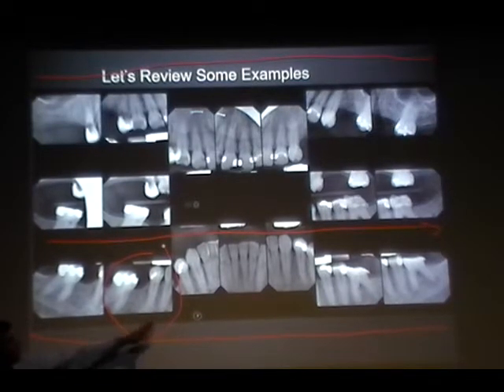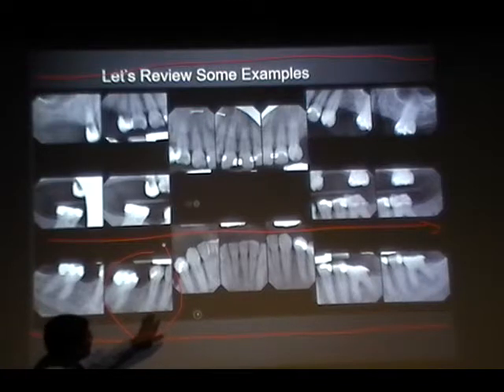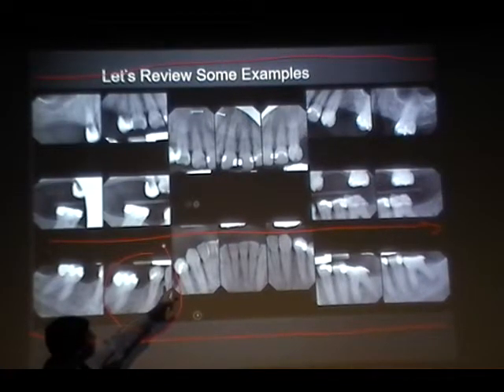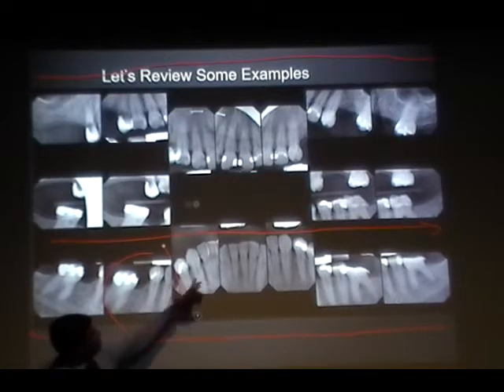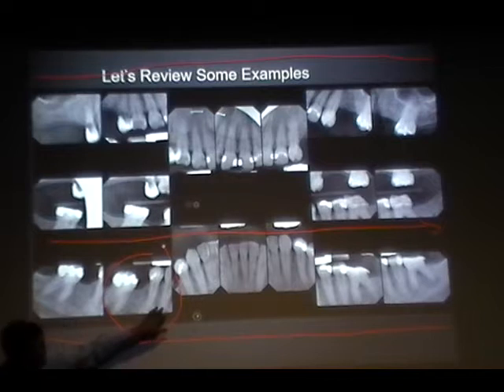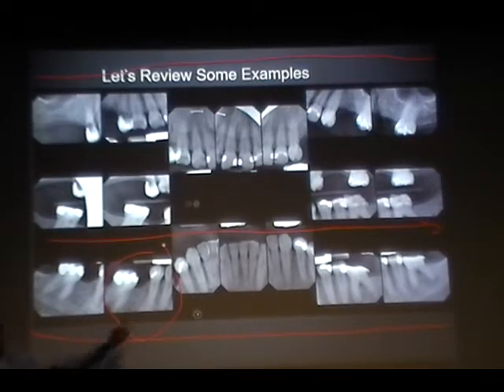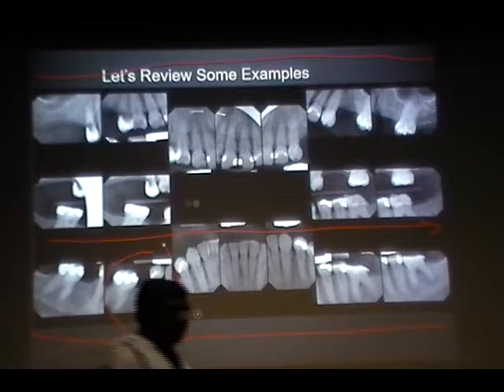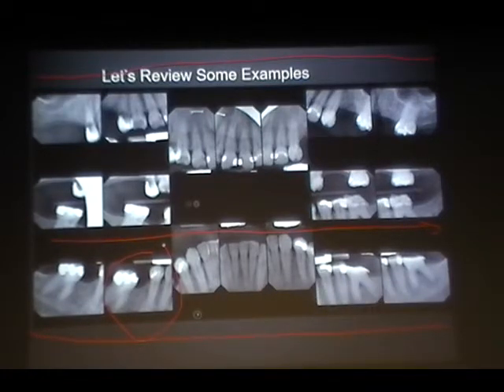And we have to capture the distal of canine, right? So we captured the distal of canine and the open contact, but you are missing the apices here. Here, you're missing the occlusal portion of the tooth. Did they also slice it a little bit so it looks like the angulation's a little off? Yes.